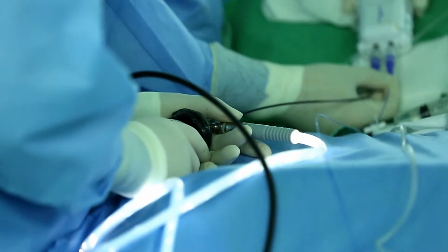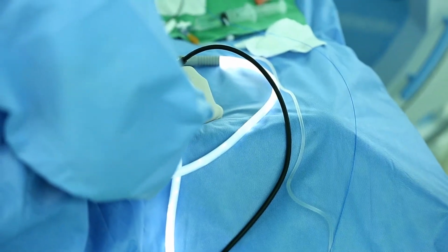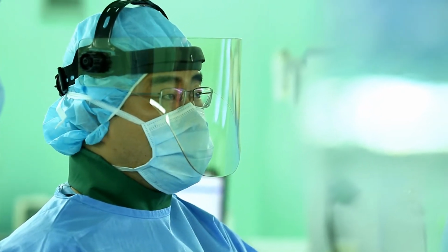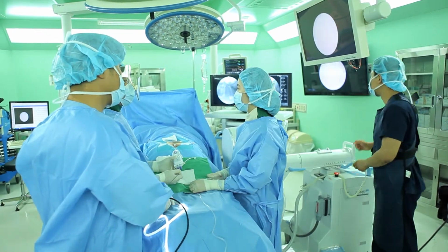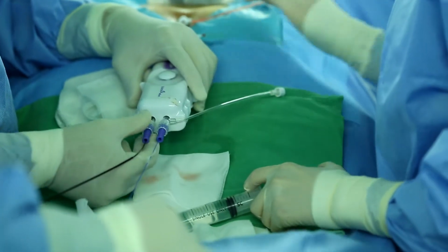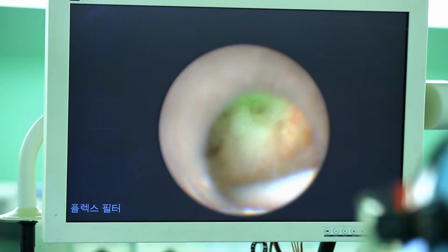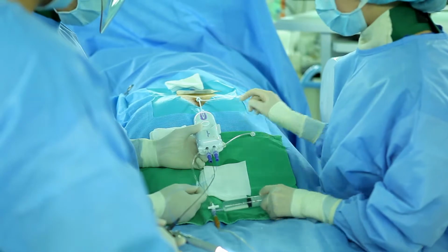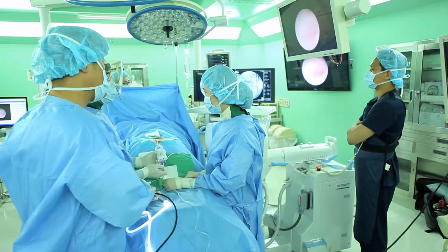The endoscopic cable is a consumable. As it is being used, the resolution will get poorer and poorer. The skillfulness of SELD will make an impact on its shelf life. If the resolution is too low to be used, it should be replaced. If it is not, you may clean the view by pushing saline. If the view is interfered with by epidural fat, you may repeatedly insert and take out the endoscopic cable while pushing saline to remove the epidural fat.